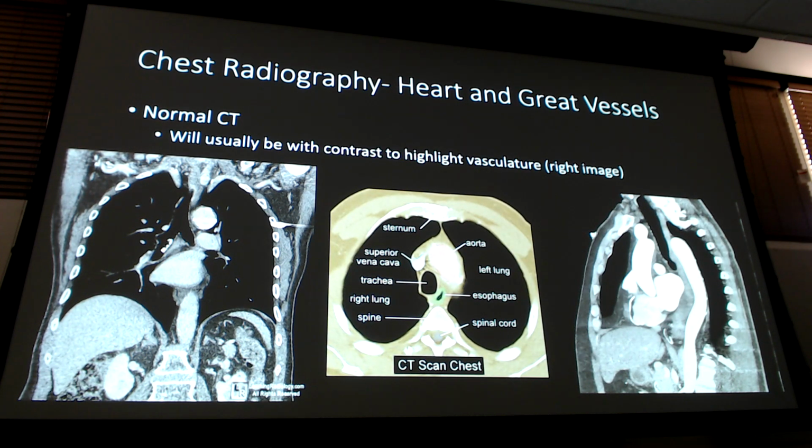This is just to show you why we do the CT scans and how you can see the trachea versus the esophagus. For the love of goo, look at the size of the trachea and look at the size of the esophagus on a CT. One's filled with air, one barely is. This is not the esophagus. How do you know that's going to be on this exam? But I will tell you, when I've done anatomy stuff in the past, the number of people that confuse the trachea with the esophagus is frequent. So don't do that.